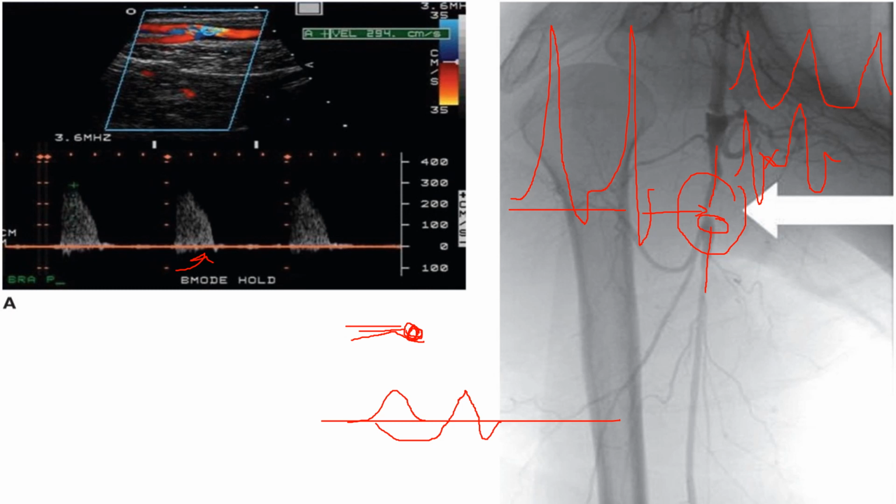Now, as we go farther downstream after the stenosis, what we usually see is that there's a lack of pressure of the blood moving through. We've lost some of the volume of our blood here at the stenosis because despite the best efforts, it's not able to get the same volume of blood through that stenotic area that it is through the vessel itself. Because of that, there's less pressure pushing blood flow forward. And so what we will also often see distal to a stenosis like this is a much lower resistance waveform.